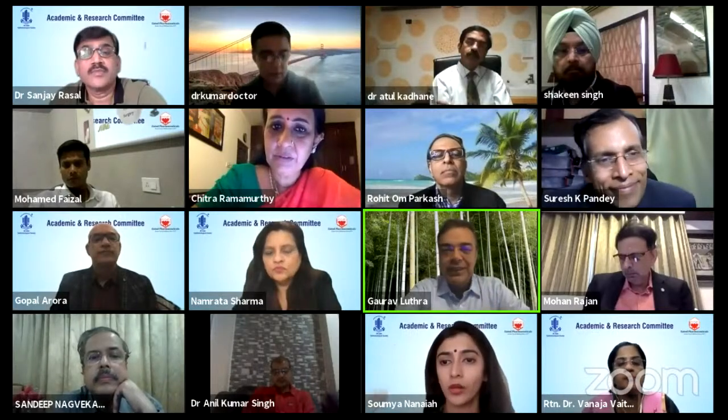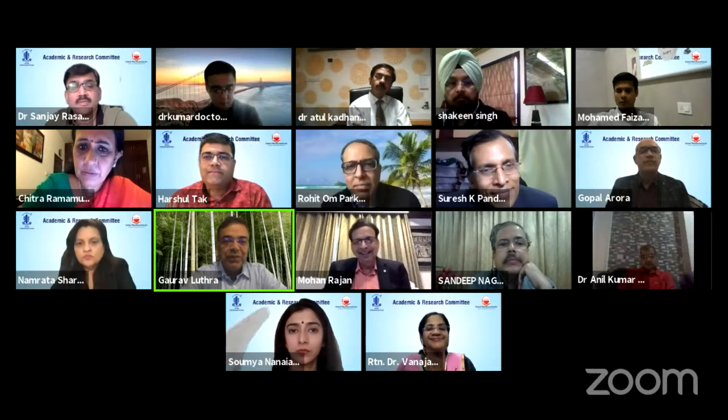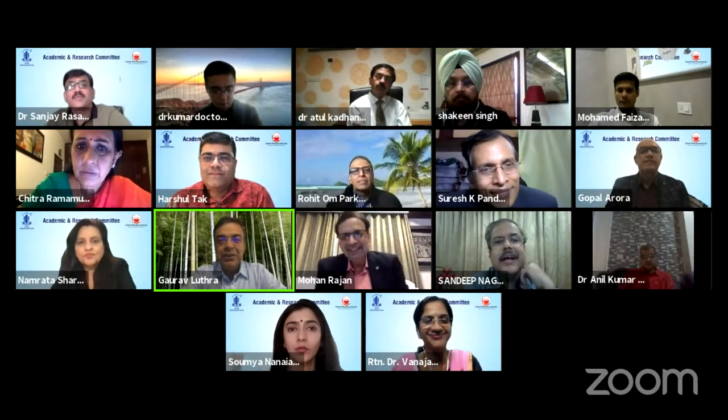Do we have anything else, or shall we conclude? I was wondering about that capsulorhexis, and it's very scary for me. And it's very uncontrolled, frankly. Dr. Mohan said beautifully, but everybody else, I think the capsulorhexis.